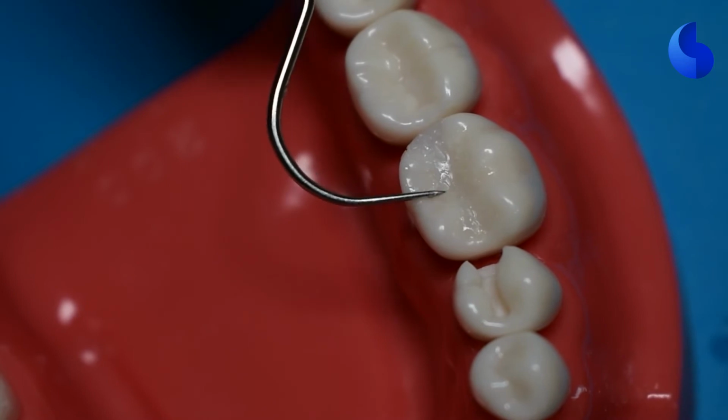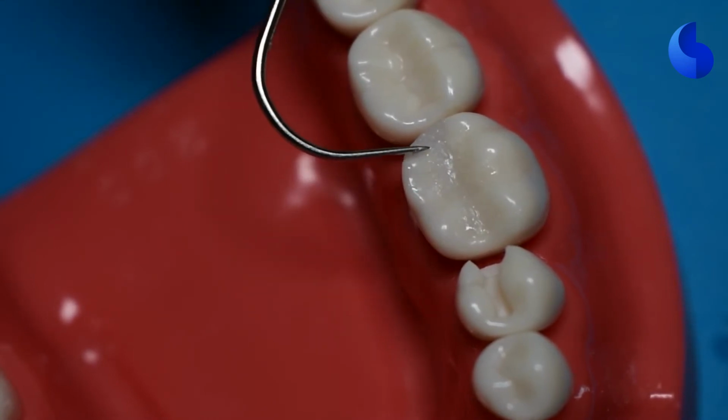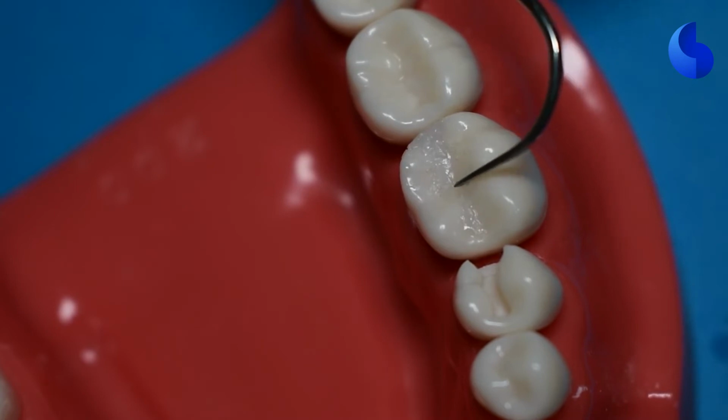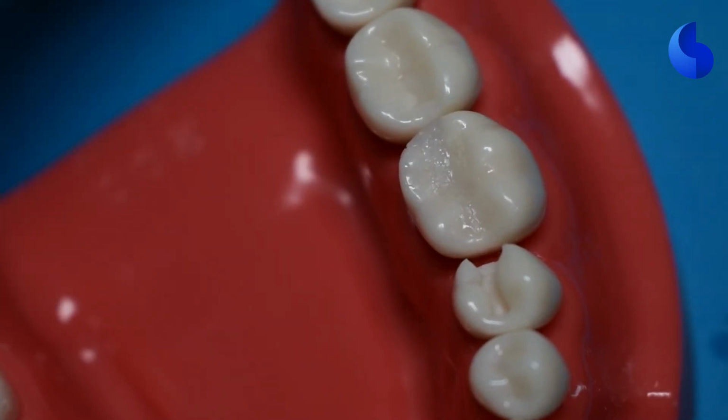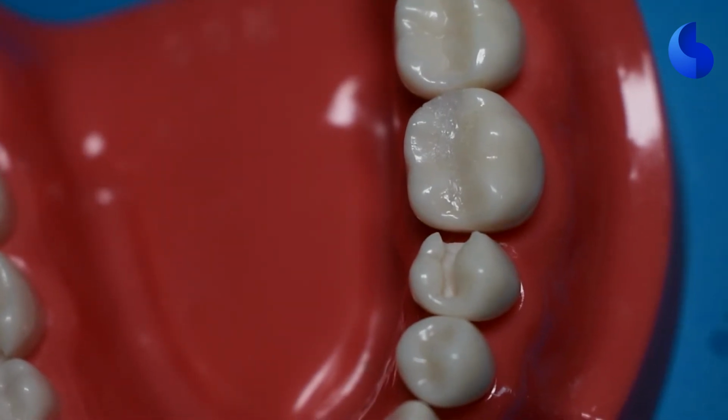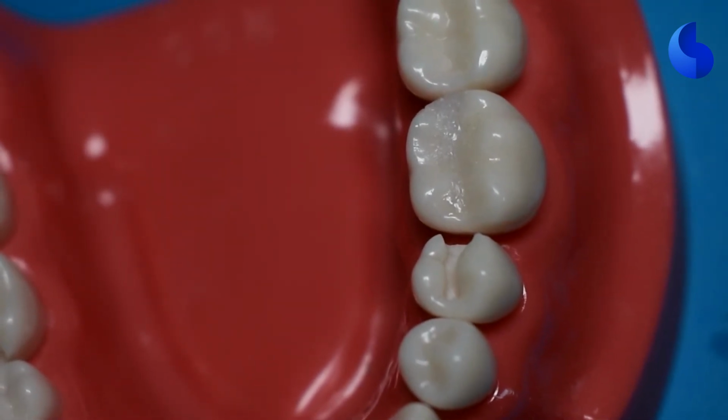Once you're done curing the restorative material, use the tip of an explorer and run it across the restoration, from the tooth to the restoration and restoration to the tooth, to ensure that it's completely hard and cured and that there are no voids that you may need to fill at this point. And when you're happy with it, go ahead and do a final cure, which will help to just wrap things up before you use a burr or something that's more aggressive on this restoration.